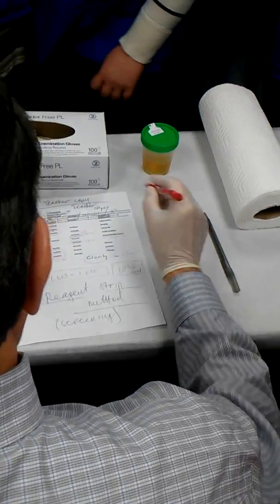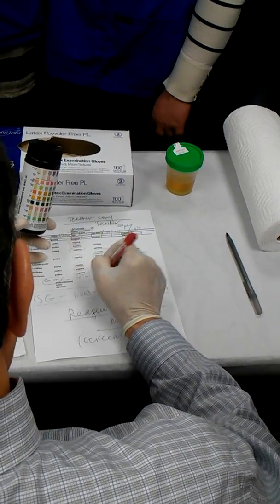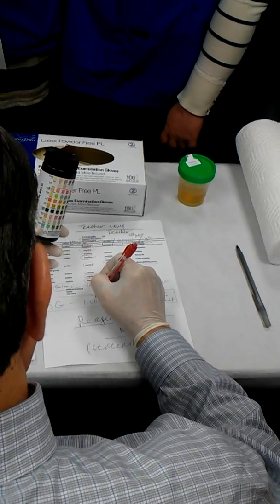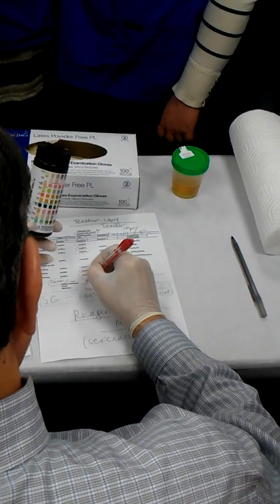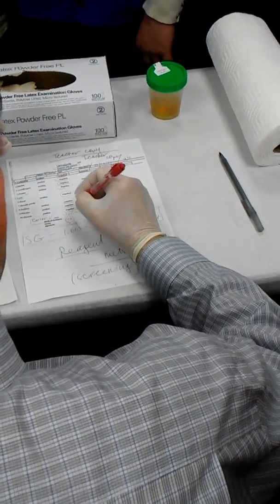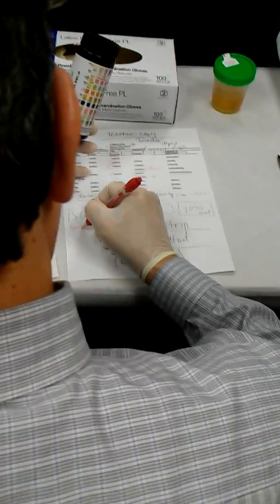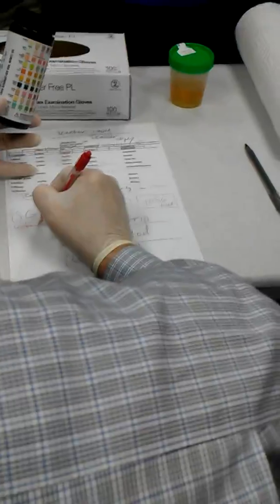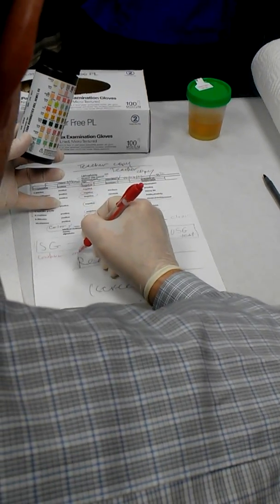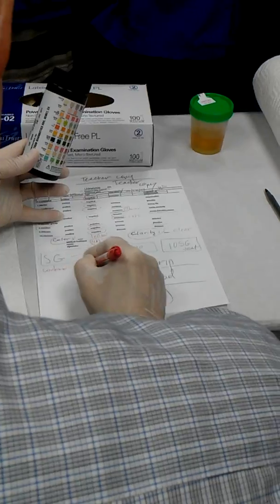Then you write your name, Коля will write his name. And signature. Name of the medical assistant, your name. That's how I will know who is doing this. So you have to clearly write your name and then signature. Conclusion: normal urine. Okay, normal urine. Okay, guys.